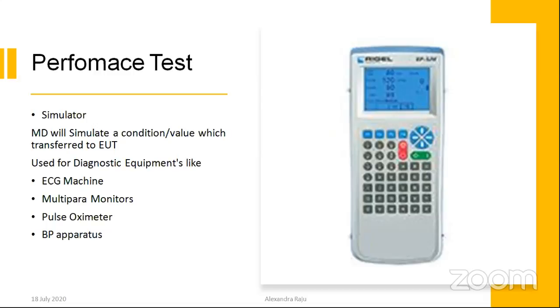We are taking a multi-para monitor. We can see the SpO2 analyzer. We can check the SpO2, ECG, heart rate, respiration rate, temperature, and pressure. Normally these are connected to the patient and the patient gives the input. But here we don't have a real-time patient. So this kind of simulator is acting as a patient with various conditions.